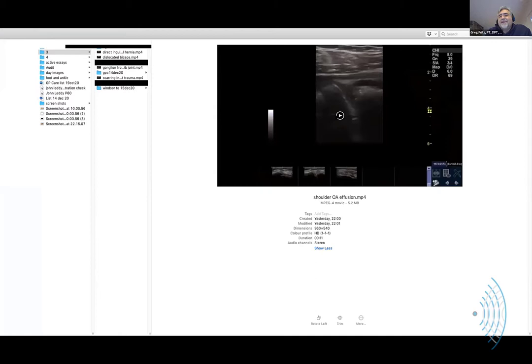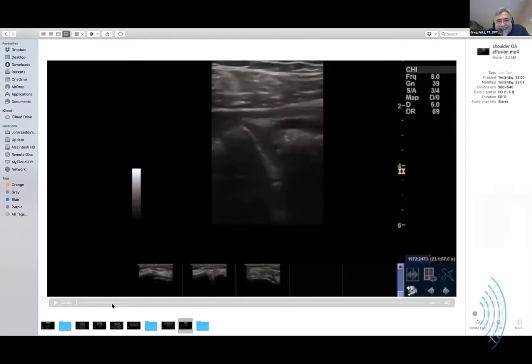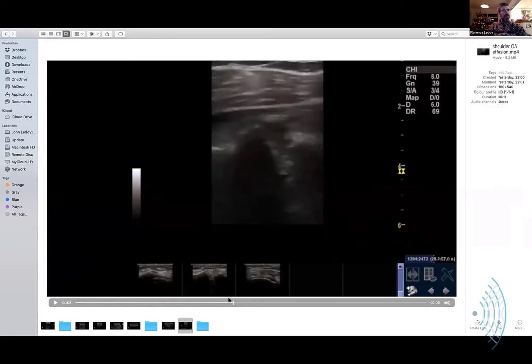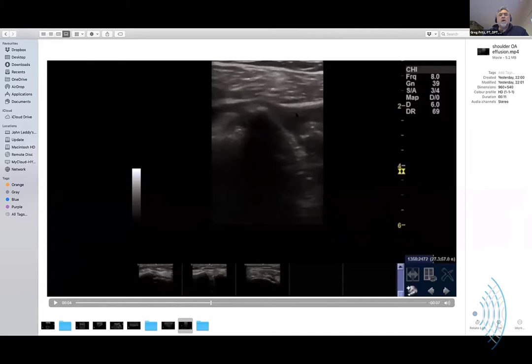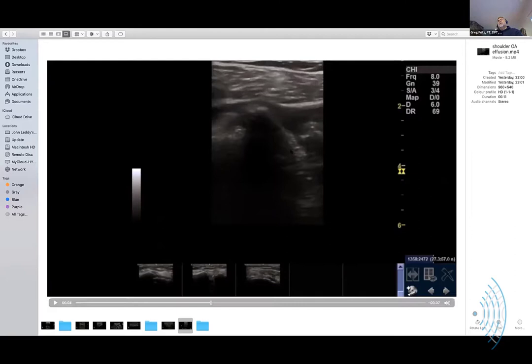This was at the beginning of this week - I didn't have a lot of time and was just having a quick look. This is the back of the humerus, the humeral head. You can see a change - some fluid in there, and the capsule is quite lax, which is common. You're looking at that and saying this isn't a frozen shoulder - classic frozen shoulders are stiff, they don't have lax capsules like that. So that's an OA shoulder. This person is a work-through-the-pain type.